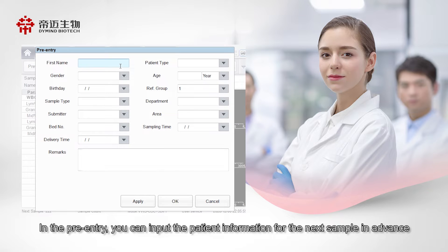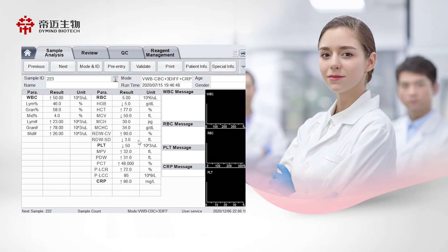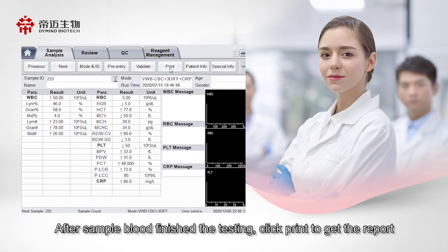In the pre-entry section, you can input the patient information for the next sample in advance. After the blood sample has finished testing, click Print to get the report.